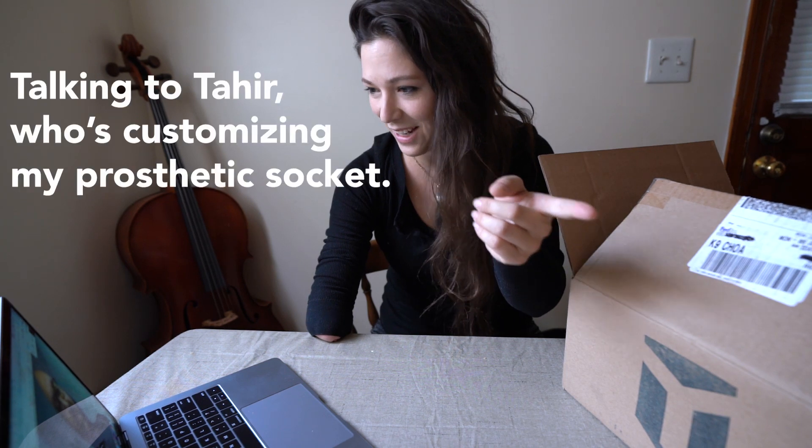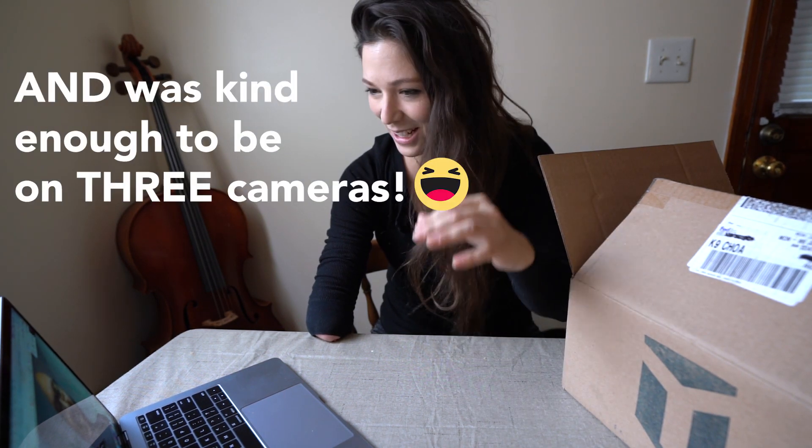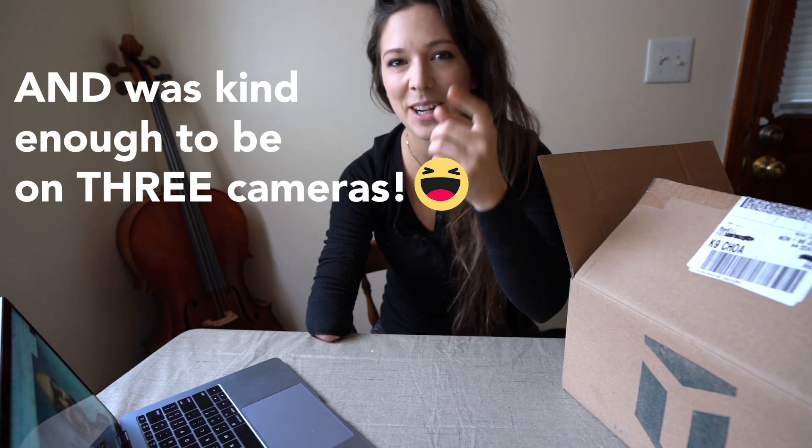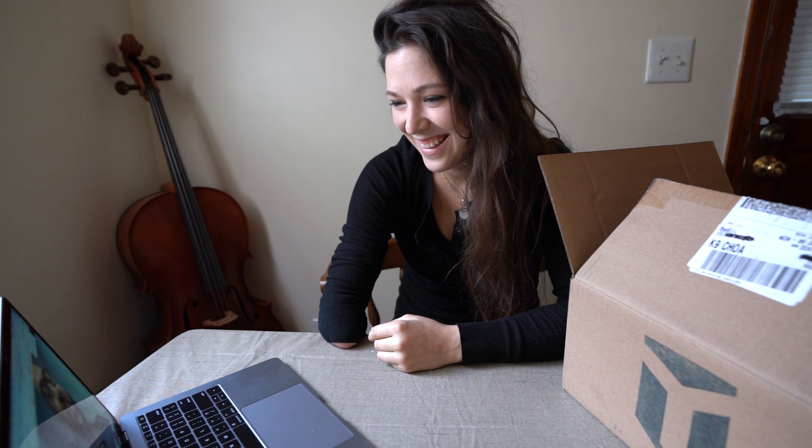I'm going to have the appointment screen via a Google meeting and you'll see this and you'll see me trying things on. I've got a TikTok livestream going with some viewers making comments, and then I have my big camera for YouTube. We've got about 20 people in the live stream.